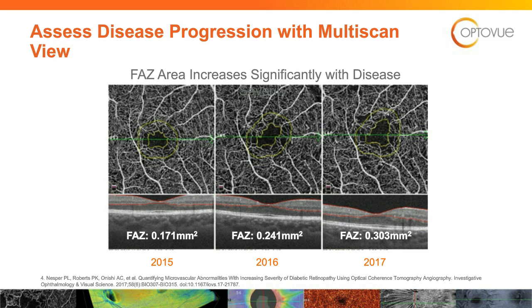Again, I really try to get a 7, 8, 9. Those are the most common. It's unusual that we get 10s unless they're in a very normal, young, healthy patient. But 7s, 8s, and 9s are really where we like to get that. So that's what we consider acceptable scan quality.